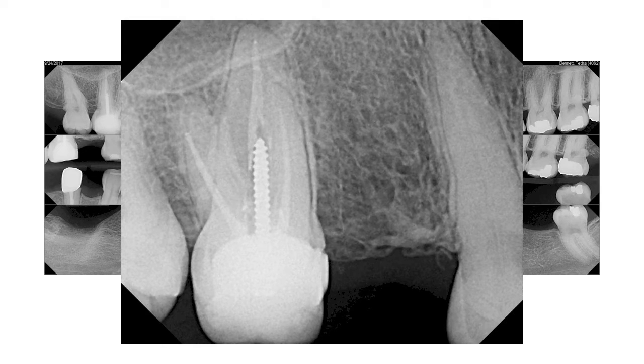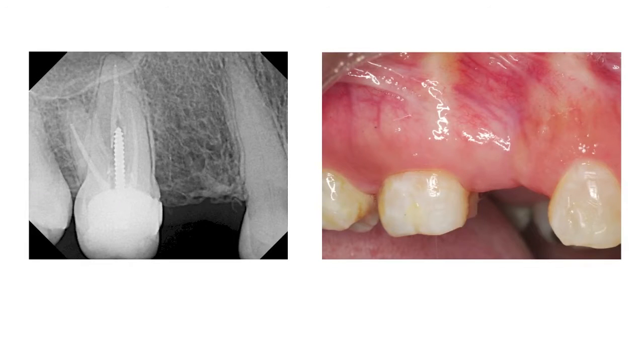And here's the reason we're going to treat this tooth. Anybody know why? Because it's going to be easy for you to see, right? When we retract Tidra's lips, it's right in the maxilla, almost in the anterior. It's easy to see, and I don't need to do what I'm going to do now and repeat it 5 times. I want the opportunity to talk about a lot of different things. So we're going to pick one simple area to treat, follow through the whole process, and then talk about more involved complex cases and how that system and those protocols are used for all of those areas.